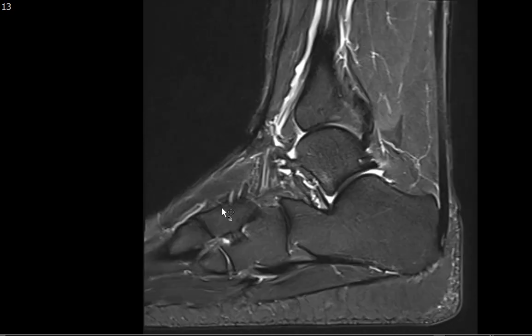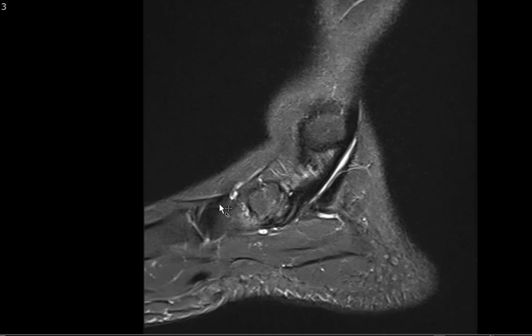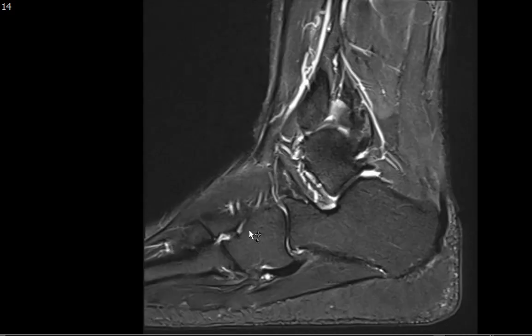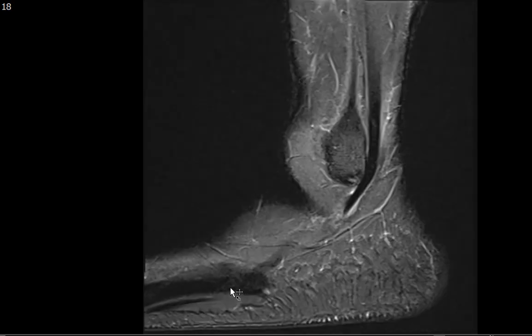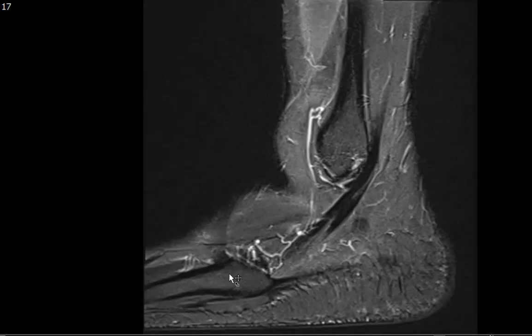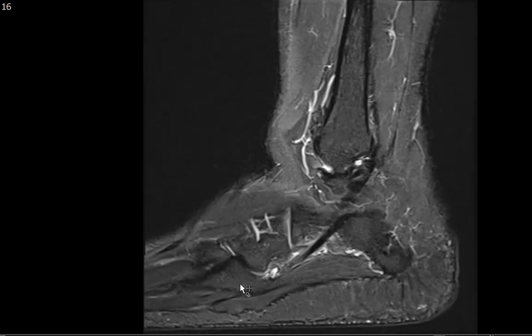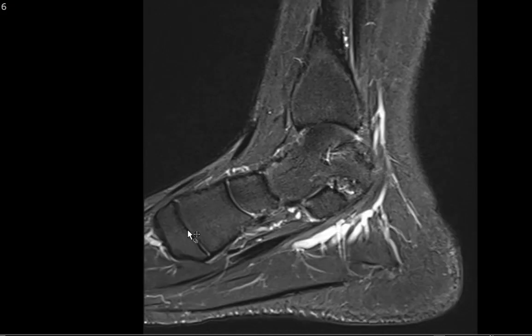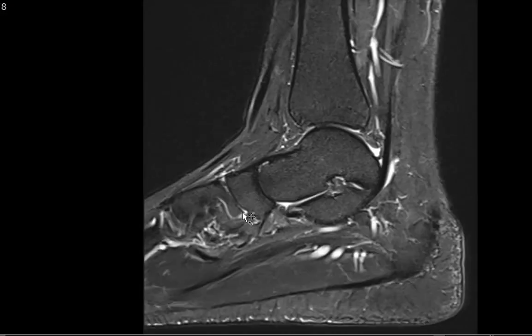The cuneiform bones — medial, middle, and lateral — look okay. The cuboid looks good. You always want to look at the base of the fifth metatarsal, where you can have inversion injury fractures, avulsion of the lateral cord of the plantar fascia, or the peroneus brevis as it inserts there. You also want to look at the fourth, third, second, and first metatarsals to make sure there's no marrow edema.